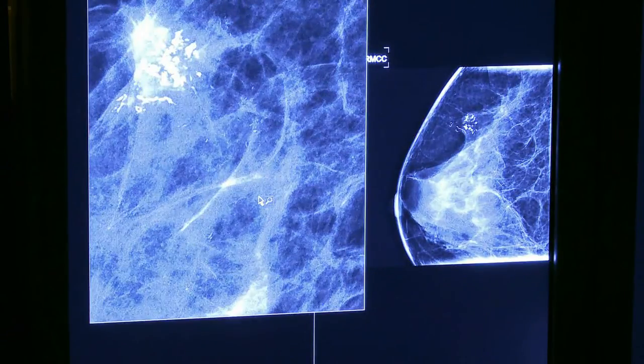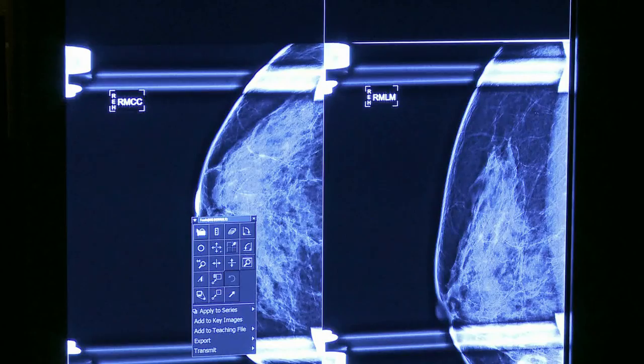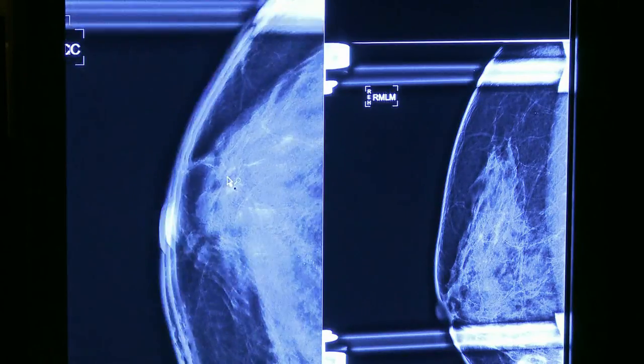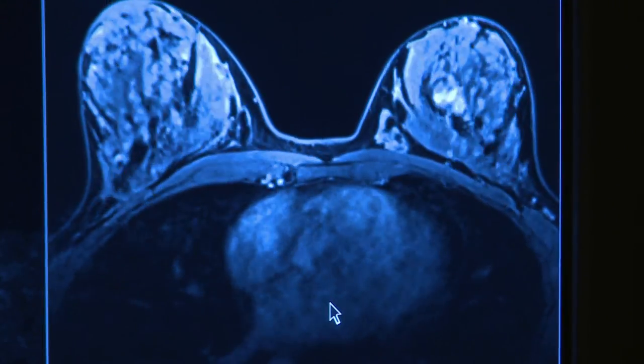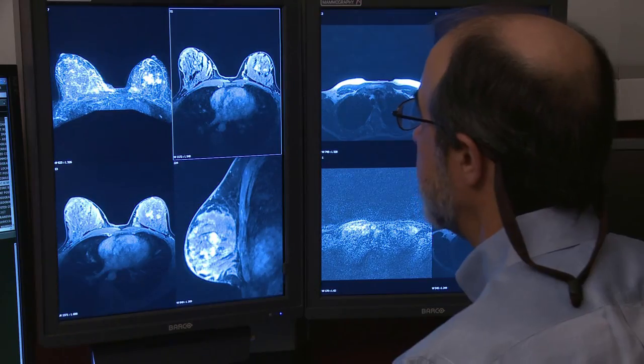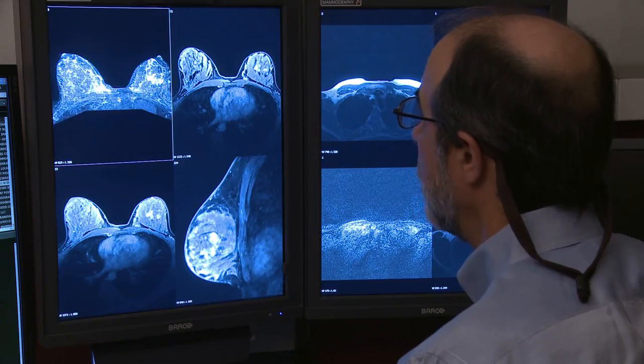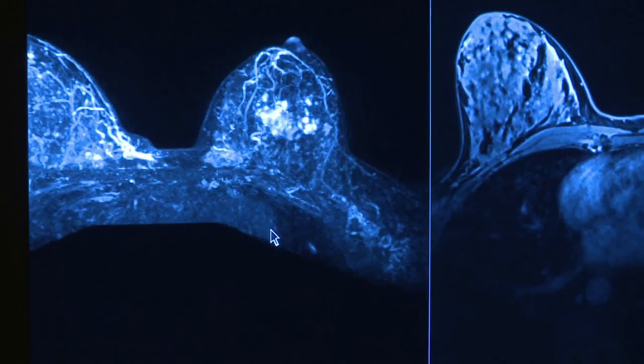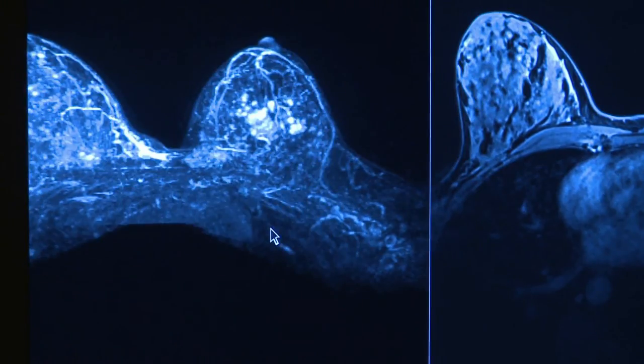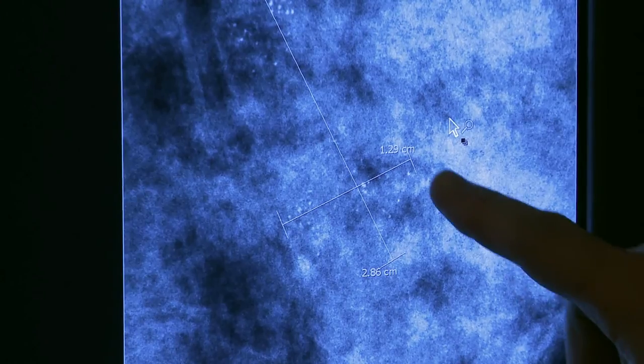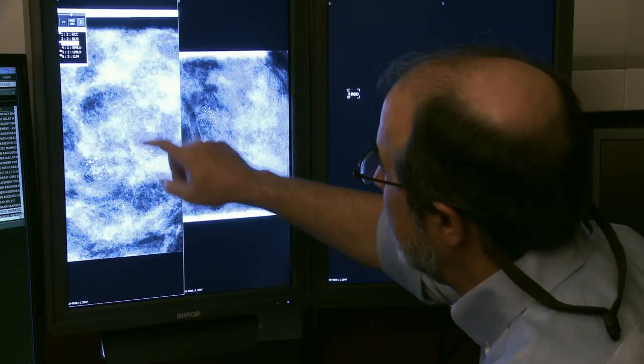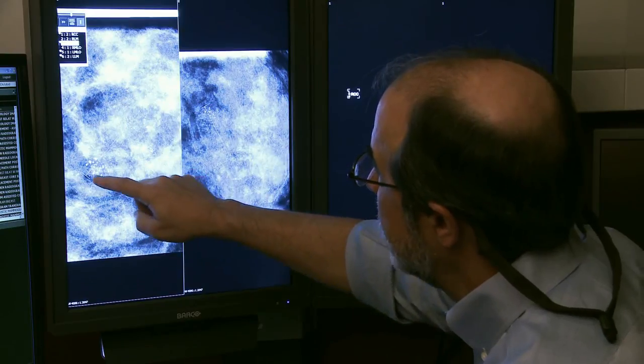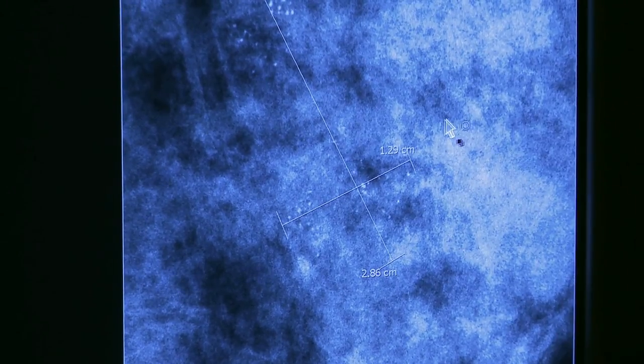In short, Rapid Frame enables displays to present moving and changing images smoothly and clearly. Images displayed with Rapid Frame do not blur or obscure subtle details. This will result in more accurate and faster diagnoses, and ultimately, in better breast cancer detection.